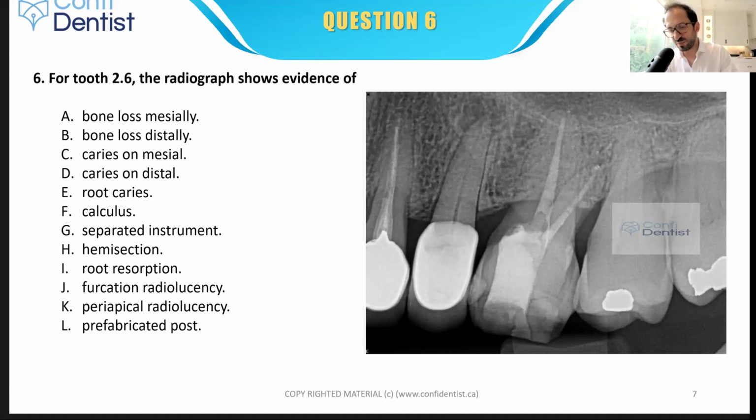So that shadow is probably for the lingual bone. We always go with the most apical shadow. That's either for lingual or buccal. We can determine, but we have to go with the one which is located more apical.